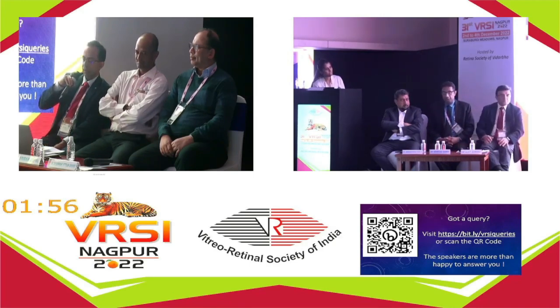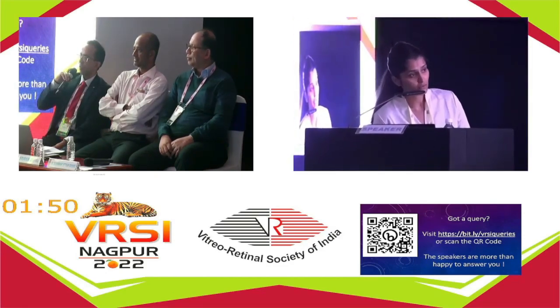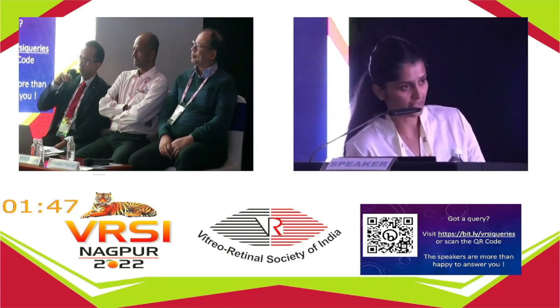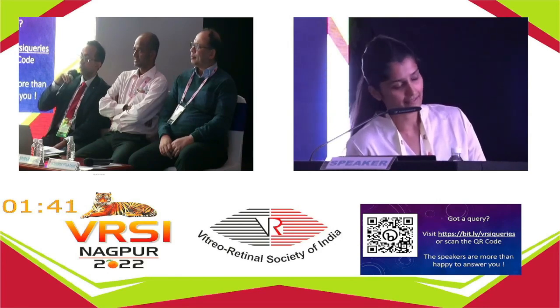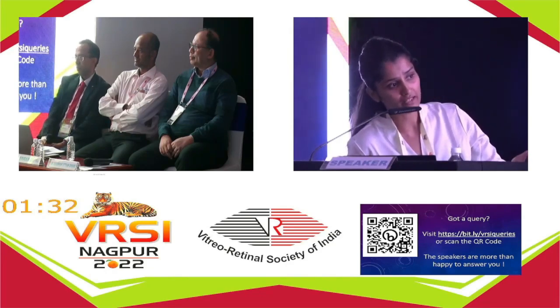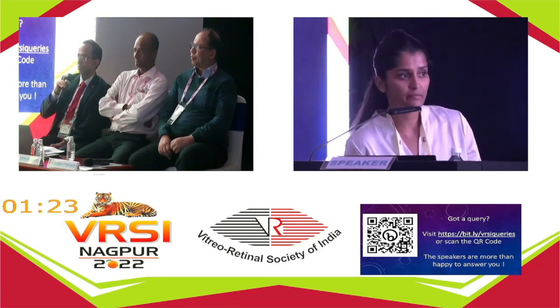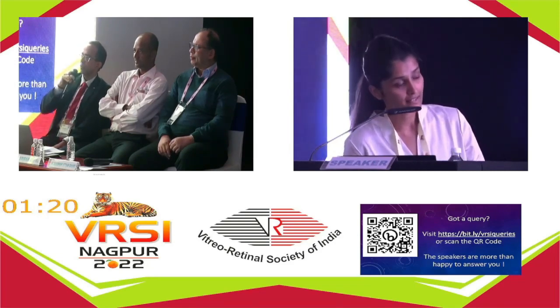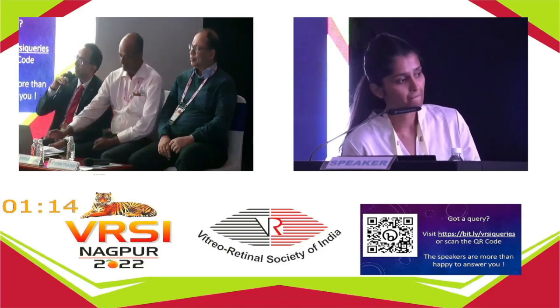Thank you. Just the last question. Of the 187 patients, 4 of them had discordant findings, and those 4 out of 187 would not have been treated if you were using only ultra-wide field imaging. Would treatment be warranted? Yes. So would that be a concern? You would miss out. That is why, basically, the peripheral blockage which happens due to the artifact may miss those stage 4 and elevated ridges in that particular quadrant. So obviously BIO is always the gold standard. Even the medico-legal fallout, I think we have to be aware of that. Any other points the wise council has to add?